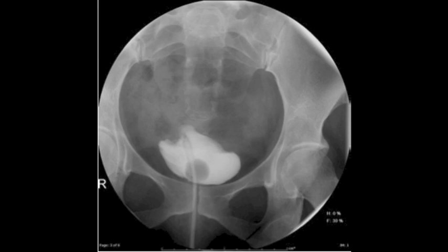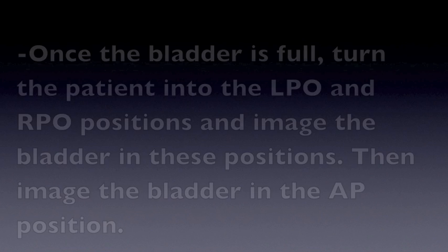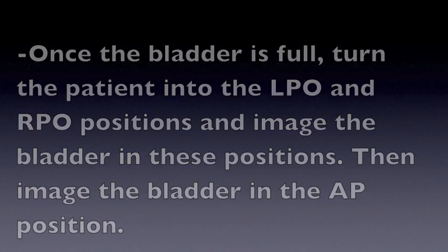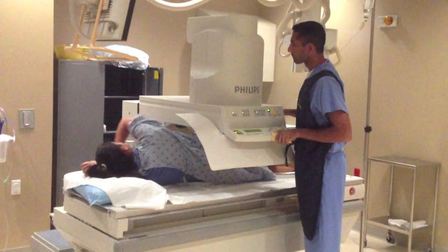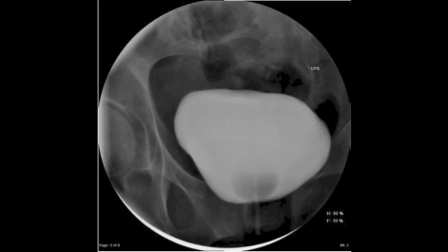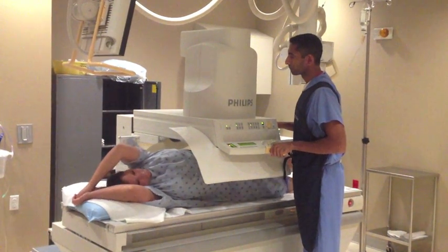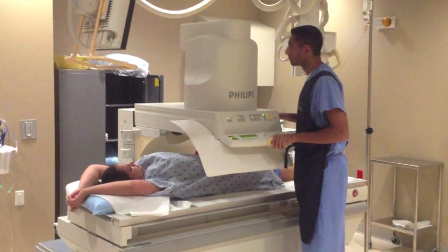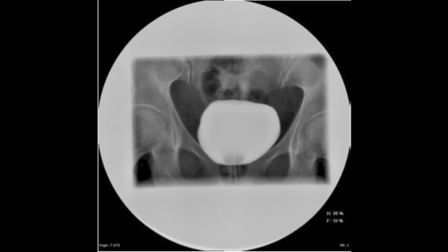This is an image of the bladder while it's filling. Once the bladder is full, turn the patient into the LPO and RPO positions and image the bladder, then image the bladder in the AP position. This is the LPO position, an image of the bladder in the LPO position. This is the RPO position, an image of the bladder in the RPO position. This is the AP position, with an image of the bladder in the AP position.